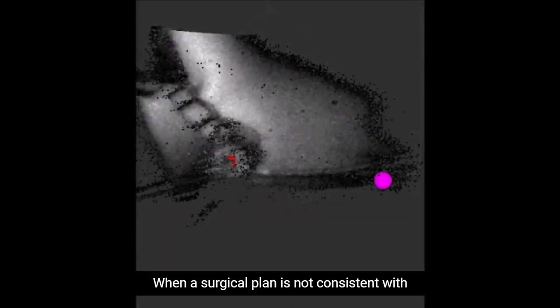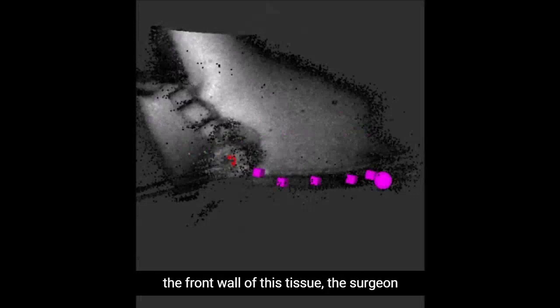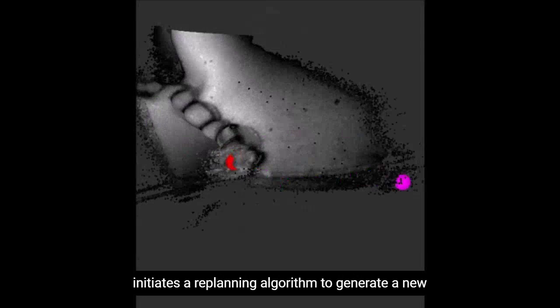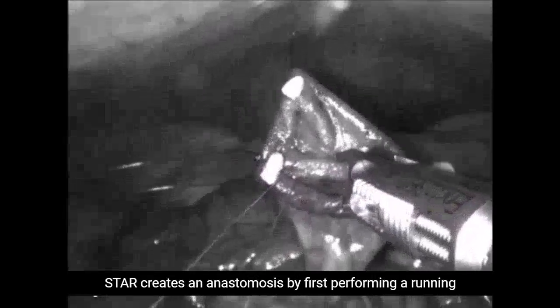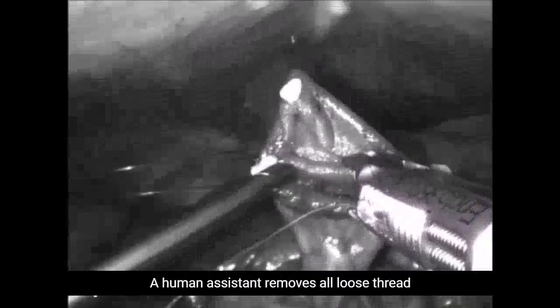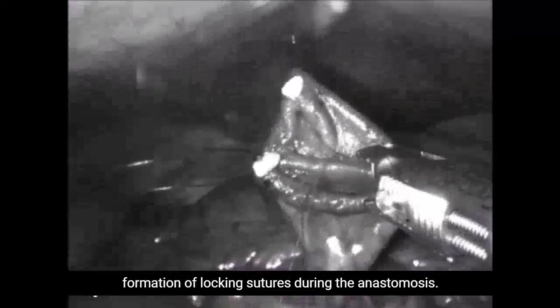When a surgical plan is not consistent with a three-dimensional point cloud, as shown on the front wall of this tissue, the surgeon initiates a re-planning algorithm to generate a new point cloud with corresponding surgical plan. STAR creates an anastomosis by first performing a running suture along the back wall of the small bowel. A human assistant removes all loose thread from the surgical field to prevent the formation of locking sutures during the anastomosis.